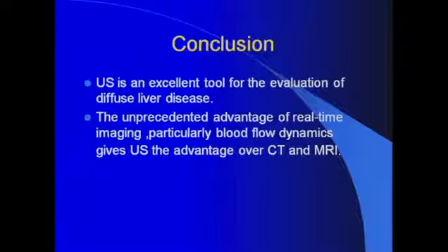In conclusion, as you can see, ultrasound is an excellent tool for the evaluation of diffuse liver disease. It still has unprecedented advantage of real-time imaging, particularly blood flow dynamics, which gives ultrasound the advantage over CT and MRI.